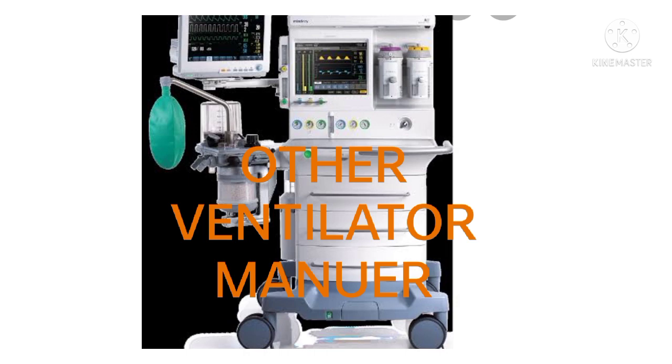High frequency oscillatory ventilation, HFOV, involves delivering a small VT, usually 1 to 5 ml/kg of body weight, at rapid respiratory rates, 100 to 300 breaths/minute, in an effort to recruit and maintain lung volume and reduce intrapulmonary shunting. While HFOV may be a useful mode for patients with life-threatening hypoxia, it has not improved survival or provided lung protection in patients with ARDS.